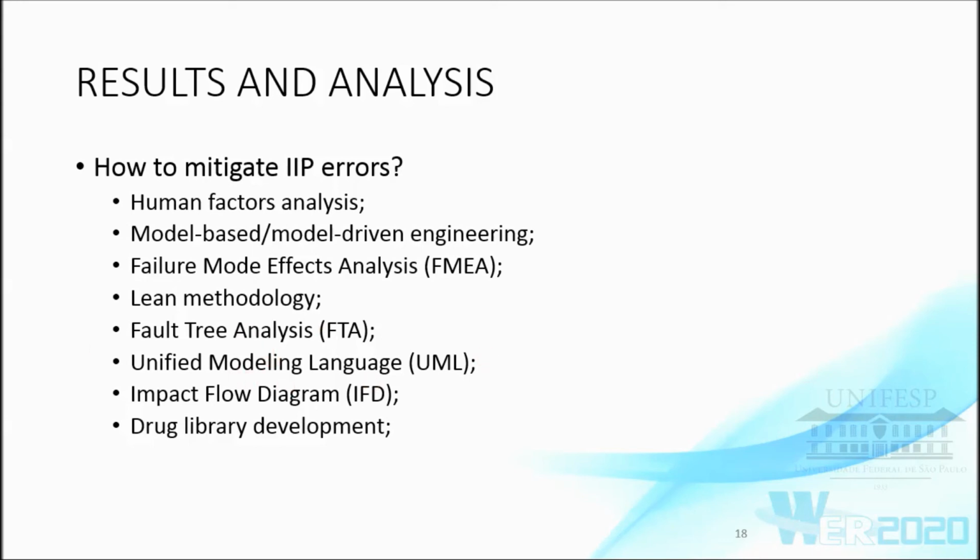The fault tree analysis, that's a technique that helps understand hazardous situations in the context of safety critical software. The unified modeling language and UML profile used to specify the design for the insulin infusion pump may help identify the requirements for the equipment.